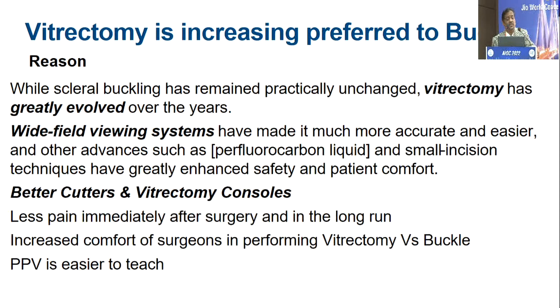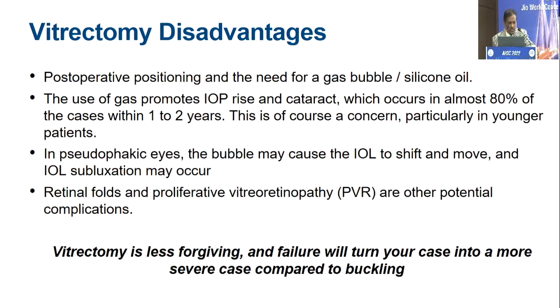And it is very easy to teach when you're doing a pars plana vitrectomy, because it's easy to demonstrate, as compared to us trying to see through the teacher's mirror in the indirect. It is a very easy way to teach. But there is a big disadvantage.